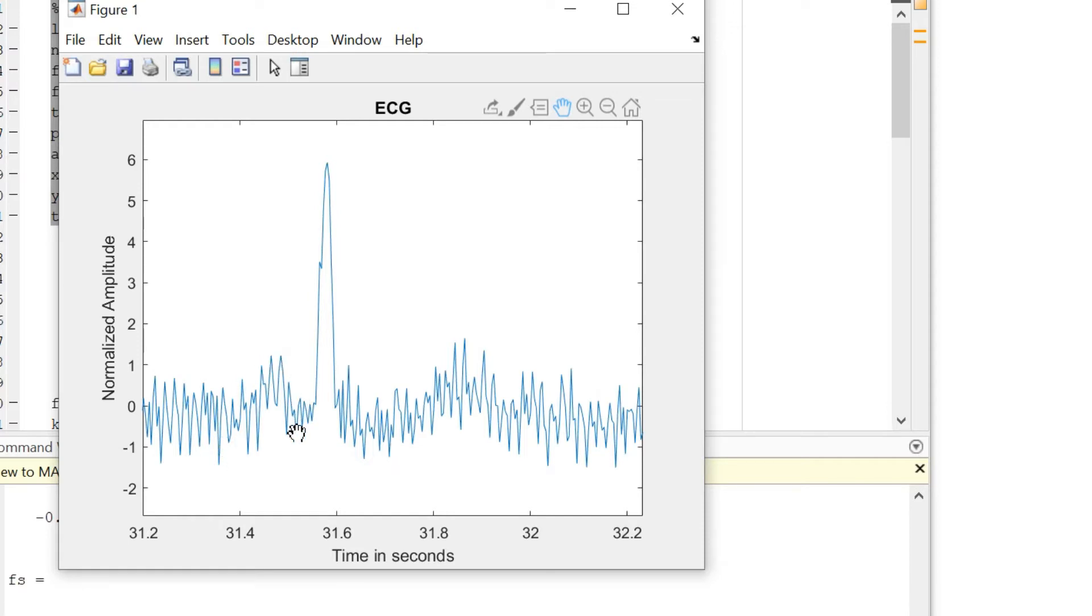This looks like a P curve. This is a Q, R, S and then a T curve.